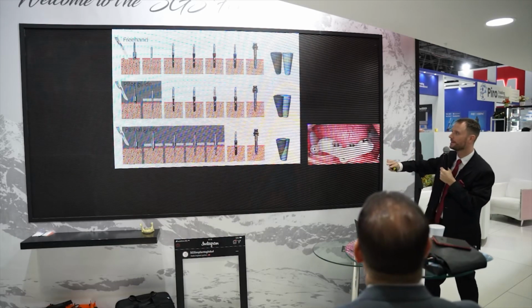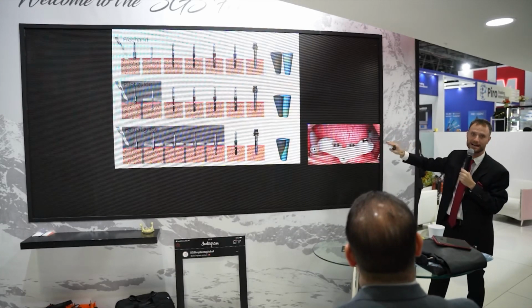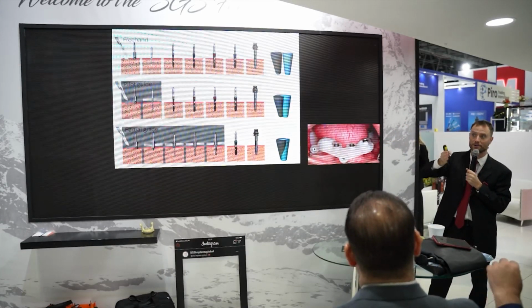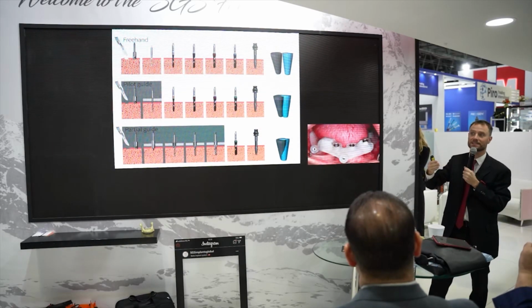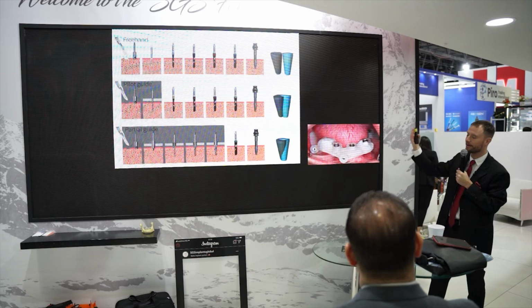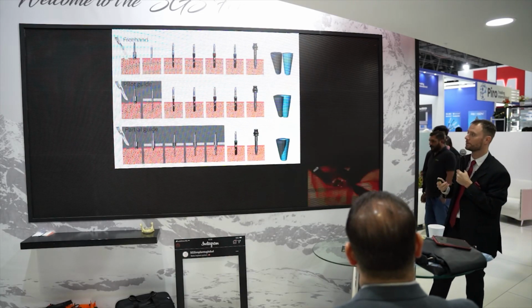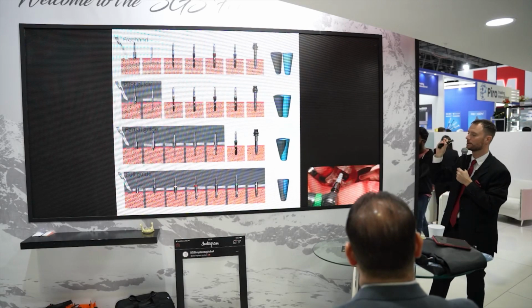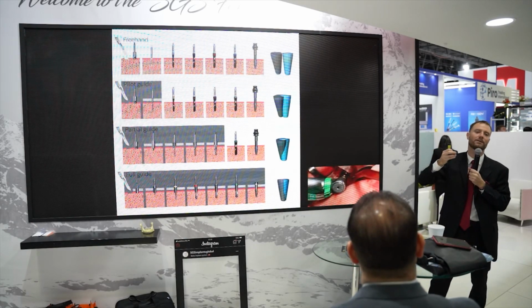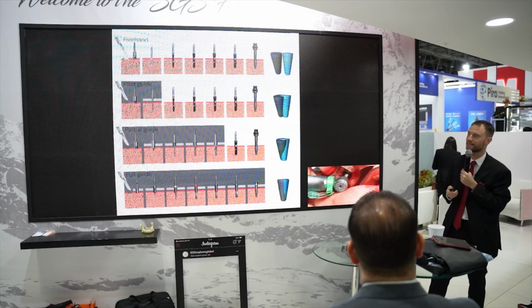Sorry guys. So group number 3 was where we had the guide. We do the drilling until the housing of the implant, but the implant itself you place freehand. Especially with these aggressive self-tapping implants, you still can have some torsion. Or group number 4 is actually when you place the implant through the guide, so the implant placement itself is guided. One more factor that influences success.